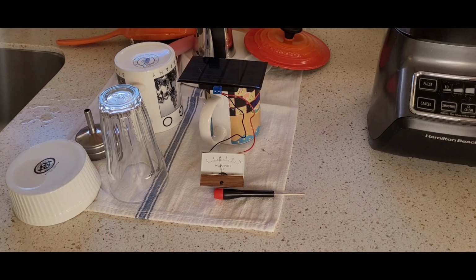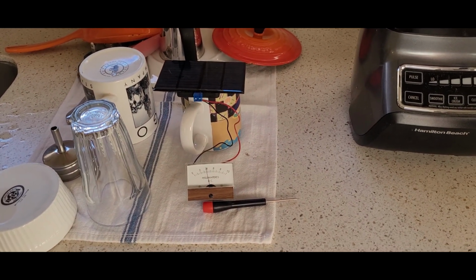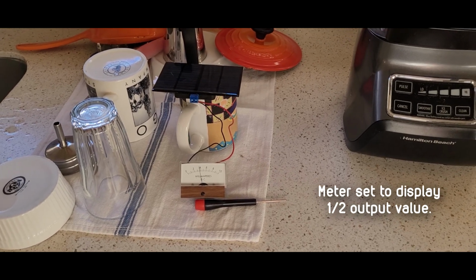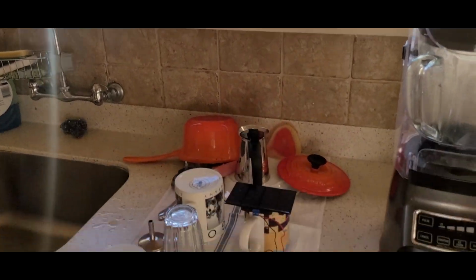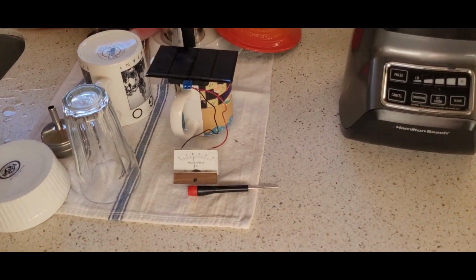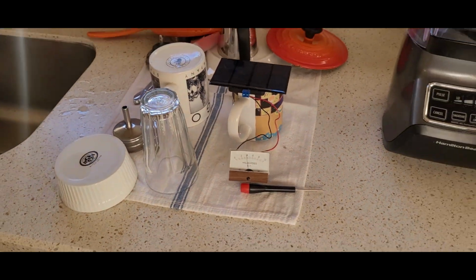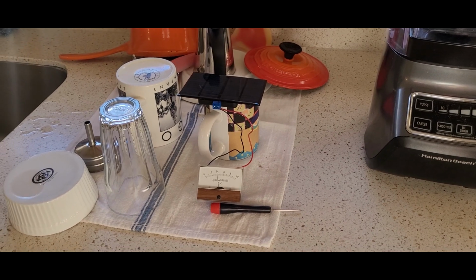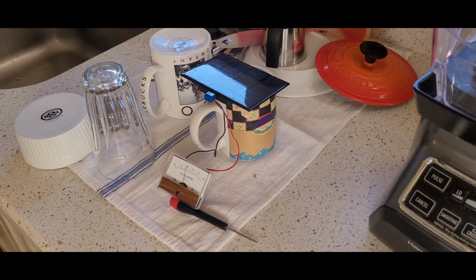And here is the famous recently washed dishes shot. So here's the solar tDCS in the house. And as you can see, it's getting about 1 milliamp of power. Even though there's no sunlight on it at all, the sun is around the back of the house here and it's in total shade. I was laughing because as I got closer, it goes up to almost full power just from the reflection from the white shirt that I'm wearing. So if you're in even modest indoor lighting, you get more than enough power to run the device. I thought that was actually pretty surprising.